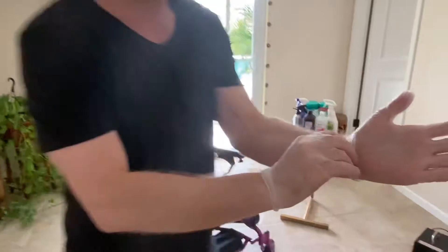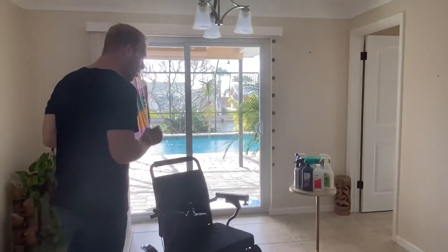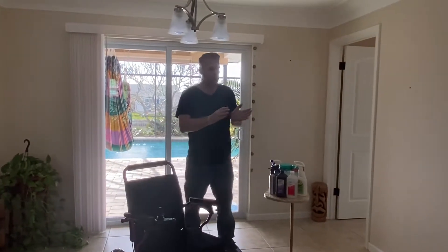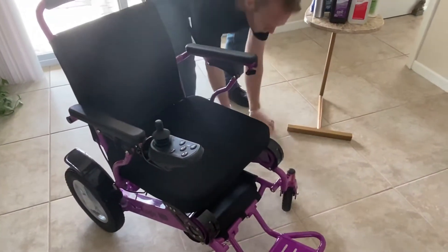As you can see, I have some disposable gloves on. Disposable gloves are a general rule of thumb. If you are concerned about germs or picking something up, this is a great first defense barrier — just having gloves when you operate your chair.